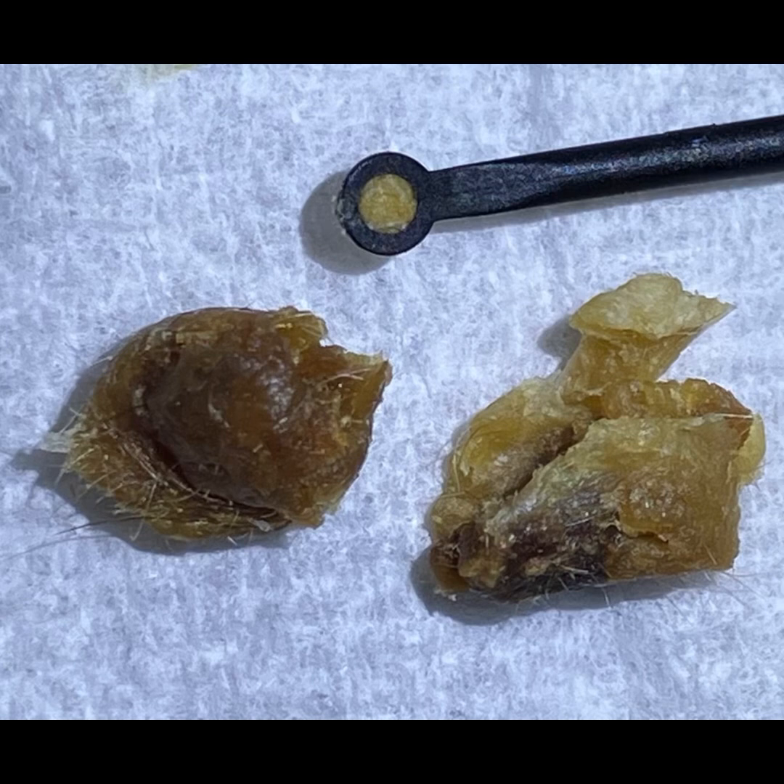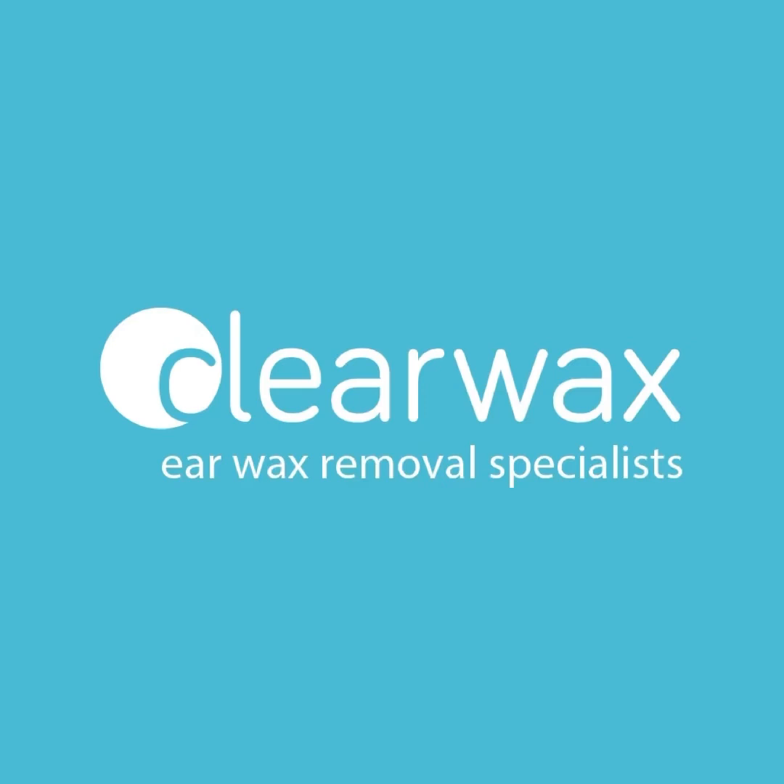There are the plugs of wax that we removed. The one to the left is from their right ear, the second ear, and the one on the right is from their left ear — you can see there's a lot more keratin there from the left ear. I hope you enjoyed that video. If you are interested in the WaxScape, please do email info@clearwax.co.uk. We're hoping to launch early autumn 2022. Thank you. Bye.